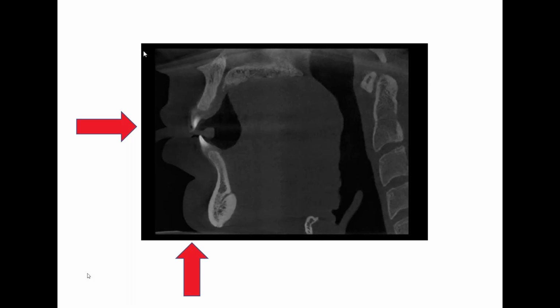Yeah, just one thing I typically will tell clients, I like to grab that bite stick and make sure that it's in there nice and snug, and then push down on that to get the chin on the chin rest there. So right, that definitely will help.